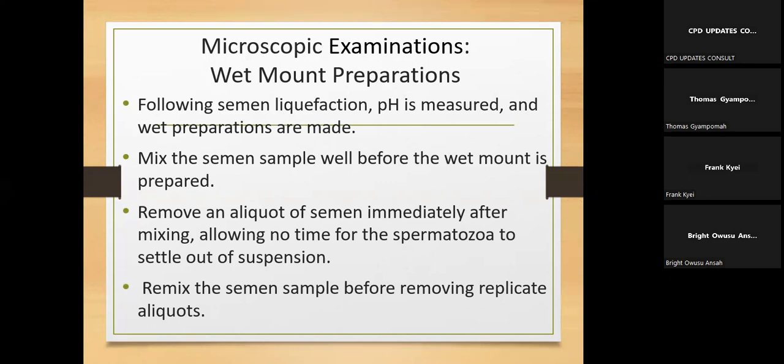That is the pre-ejaculate weight, because we're saying that the container you're going to give the patient should first be weighed. The value should be written on the container. As soon as the sample comes in, weigh it again. So you get the post-ejaculate container weight, and then you take the difference. The difference will give you something in grams.